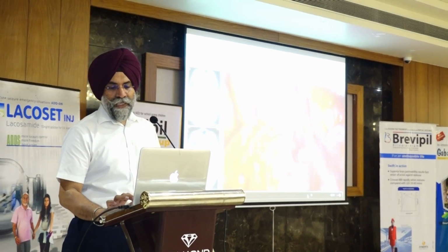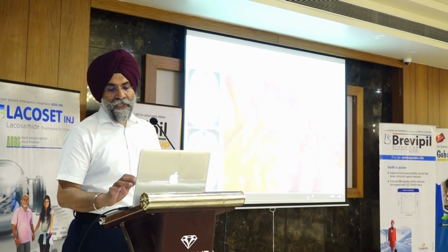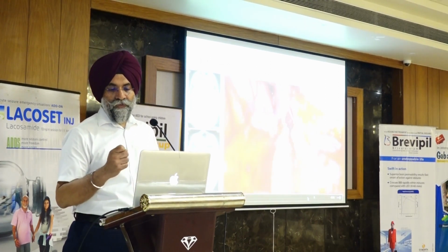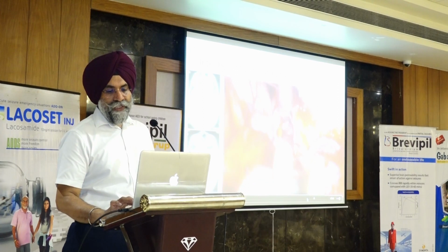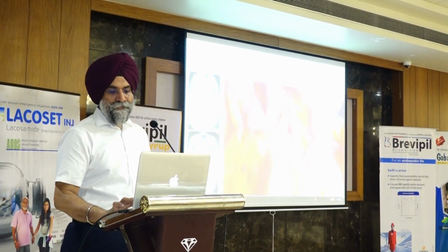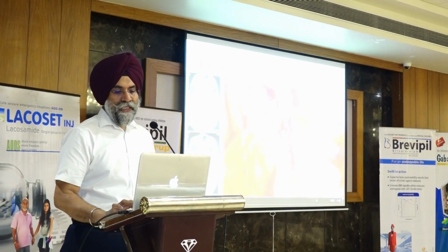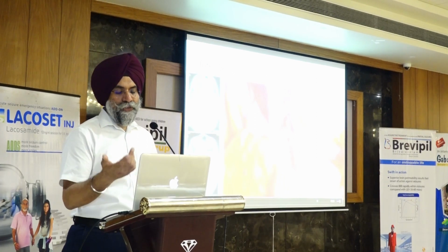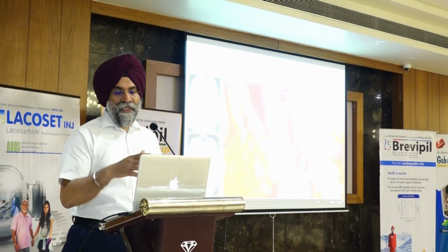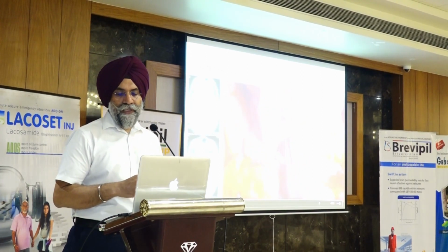We are having the bilateral PCA vision. We have ICA vision. We have the third nerve on the ipsilateral side. And under the tumor, we can see the third nerve also on the opposite side. Now we are going superiorly to find the pituitary stalk. Actually, this pituitary stalk was completely replaced by the tumor. I tried to dissect it off, then I found that there is practically no pituitary stalk connecting the pituitary gland to the hypothalamus. So it was all replaced by the tumor. So I purposely sacrificed it so that I can achieve the complete tumor excision here.